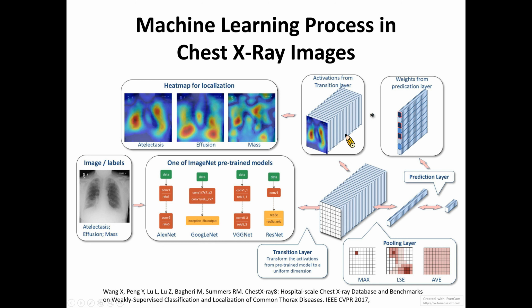I call this an AI-ready data set. AI-ready does not mean that it will generate a very good model, but it just means that all data are already structured into specific folders and categories that can help facilitate the training process.